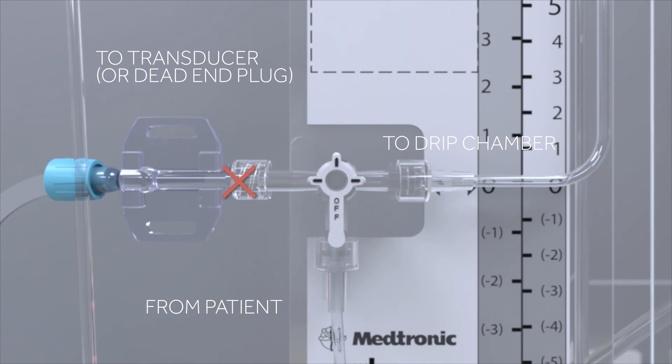If the OFF position is rotated toward the patient line stopcock, fluid flow from the patient line would stop, inhibiting flow to either the transducer site or to the drip chamber. Finally, if the OFF position is rotated toward the drip chamber position, fluid from the patient line stopcock flows to the transducer adapter but is inhibited from flowing to the drip chamber.